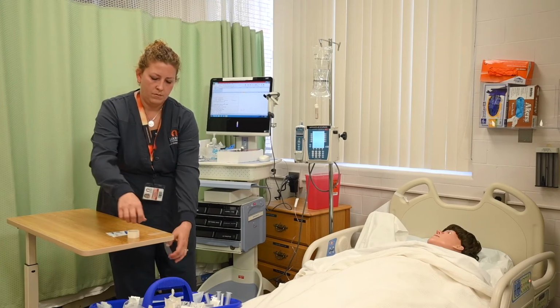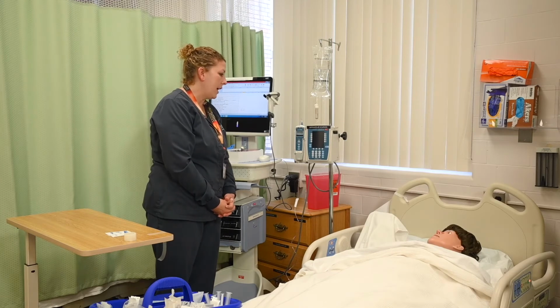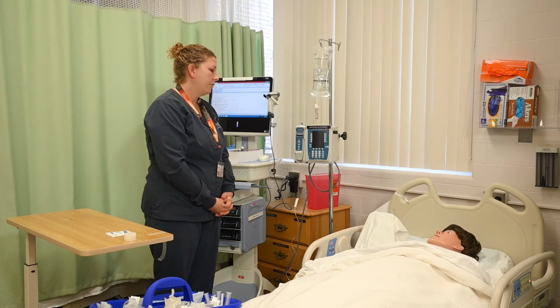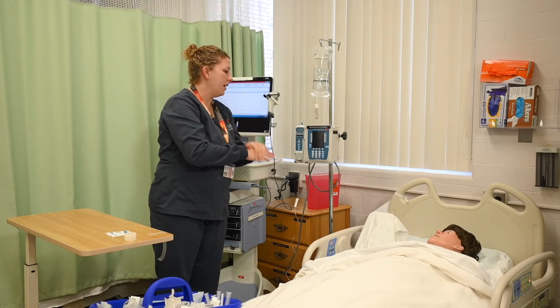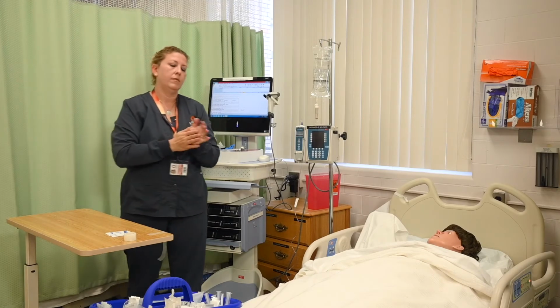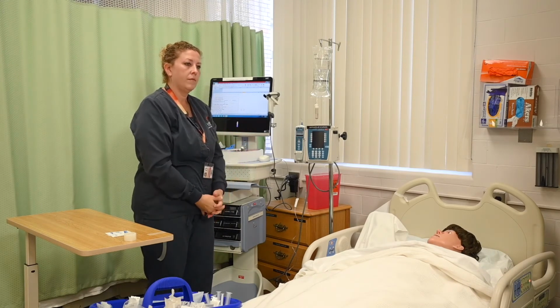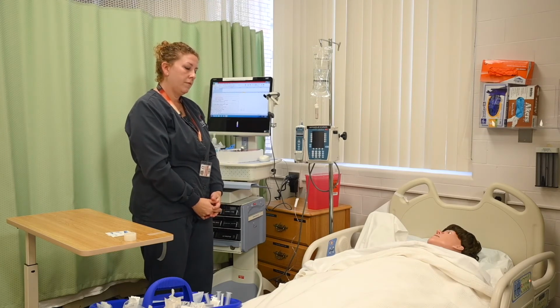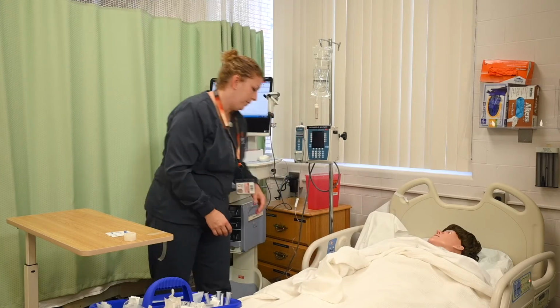Introduce herself to the patient. Hi Ivy, I'm Sarah. I'm your student nurse again today. Perform hand hygiene and provide privacy. I'm going to pull your curtain for privacy. Identify the patient using 2 patient identifiers, patient name, date of birth, medical record number, and compare to the patient's NUR. Scan patient. Can you tell me your name and date of birth?